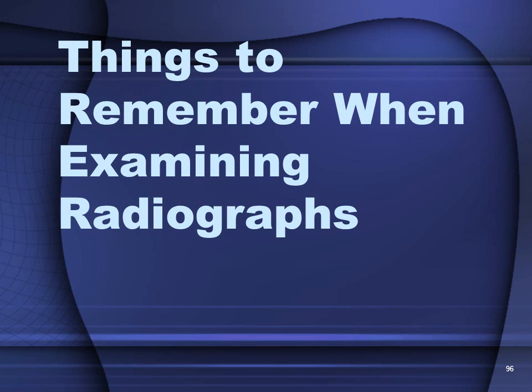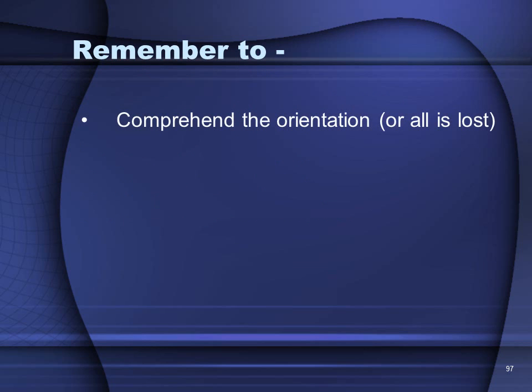Finally, just to recap the things to remember when examining radiographs. You want to remember to comprehend the orientation. If you don't understand the orientation of the film, all is lost.